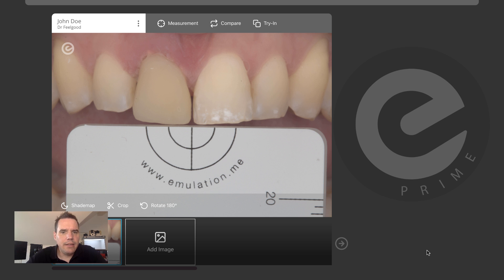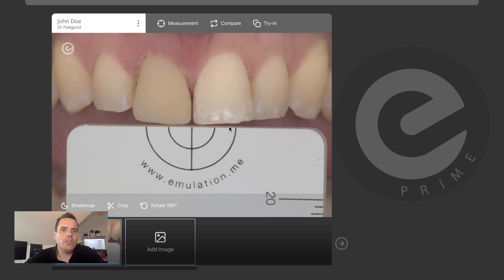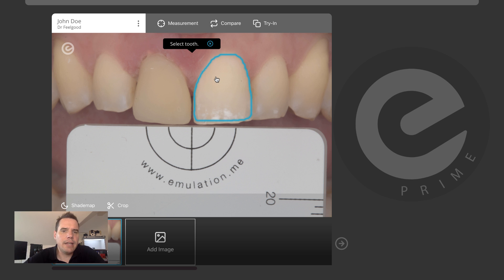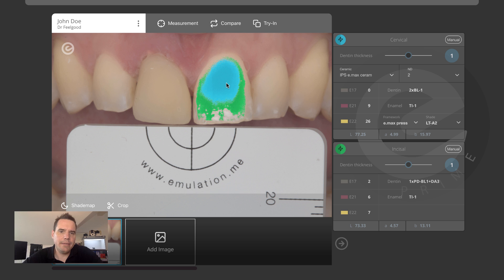Once this is done, there is nothing else to do. There's no need to calibrate the image, there's no need to click on the image. You are ready to jump right in and measure tooth color to get a patient-personal mixing recipe. In order to do that, you simply click on measurement, select the tooth that you want to copy — which is the 21 here — and then Prime is going to generate a mixing recipe based on that.